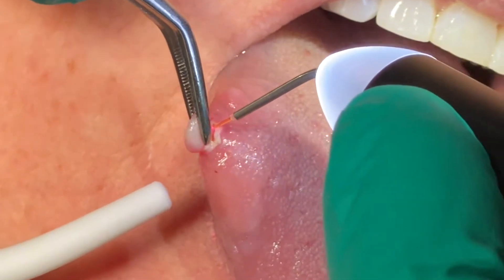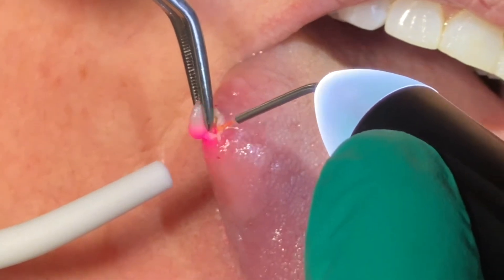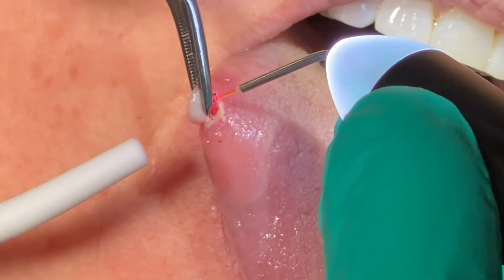You can see how quickly and readily — every time we do this, we do biopsy it. The more pressure I put on it, the quicker it will separate. We do this as a sutureless technique.